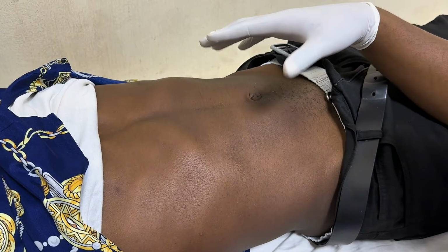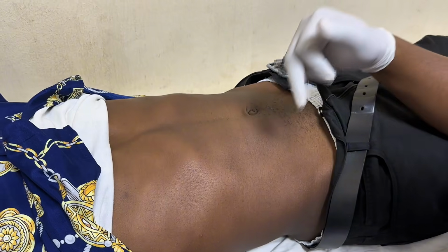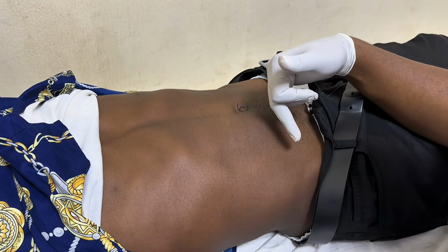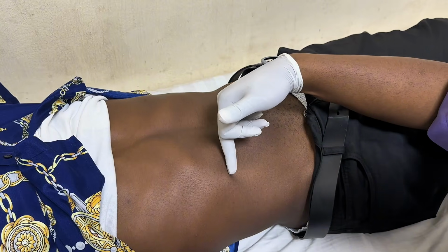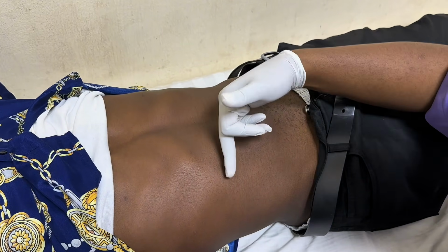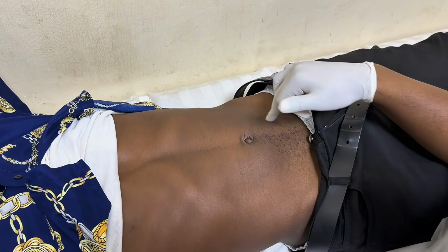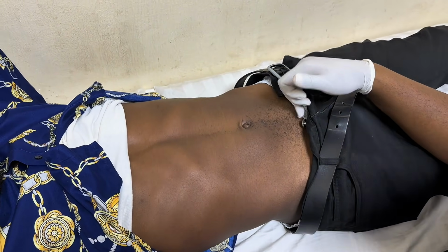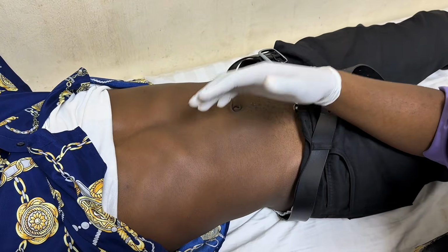Basically, when we are carrying out the bowel ultrasound, anatomically, we know that the large colon starts from here, the ascending starts from here, and then the transverse goes around here, while the descending comes around here, then the sigmoid down to the rectum around this region here. That's how we see it anatomically.